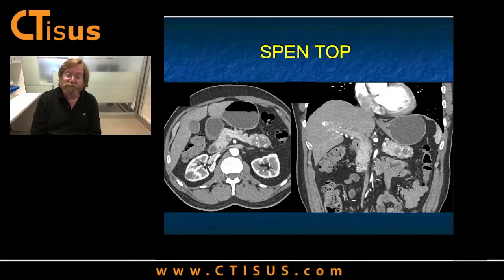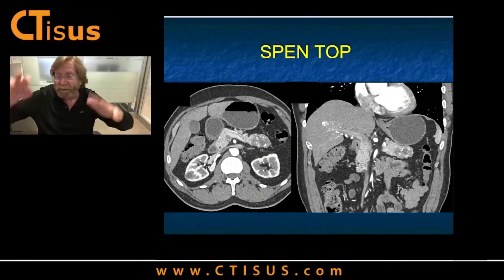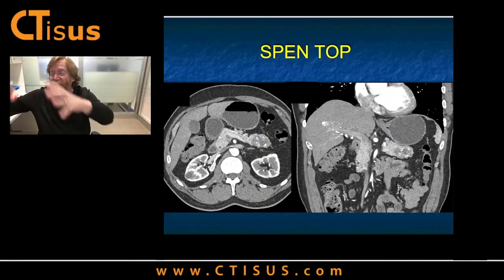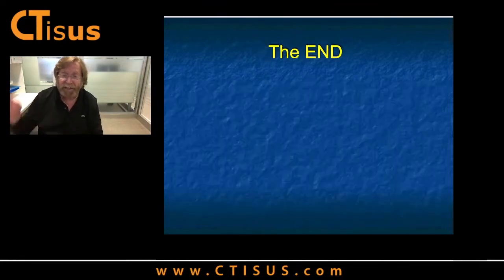We talk about lesions of the pancreas that calcify. Right up there, neuroendocrine tumor. Peripheral calcifications, MCN in the body, but it's cystic. Punctate calcification, serous cystadenoma. SPEN tumors can have peripheral, they can have central. When you see it in the pancreas, you've got to think about a SPEN tumor. SPENs are rare, usually young females, but we've seen them in men. We've seen them in older females. The age of what counts as young gets older, and the tumor seems to be going into older age. With that, I'll stop there.